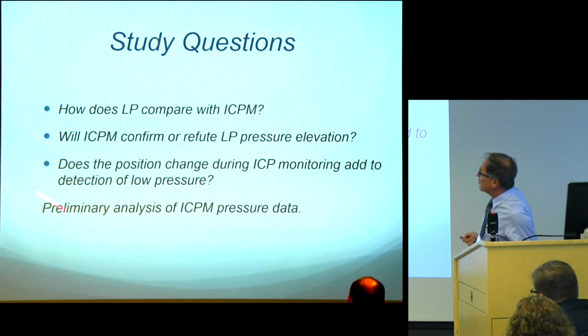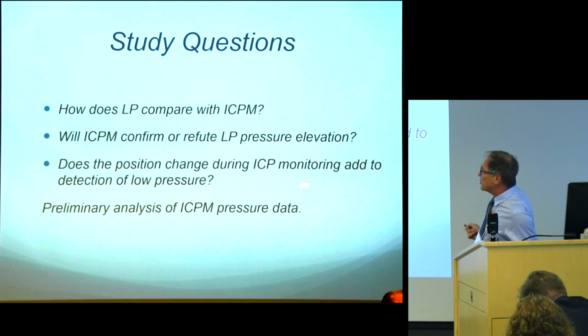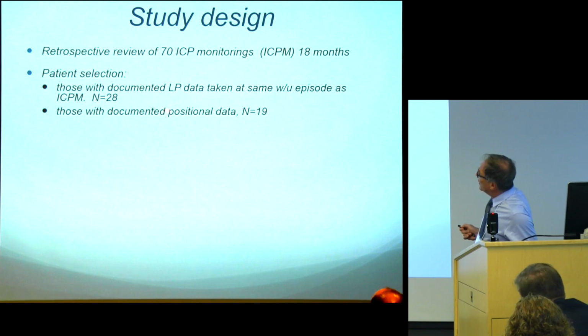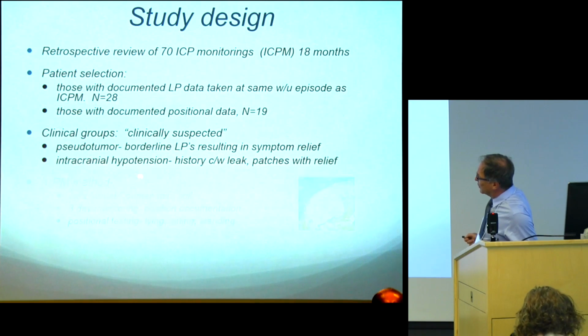The questions in the study that we did, and I'll go over this in about 2 minutes, is how do LPs compare with our new ICP monitoring, and do they refute or confirm the LP pressures, and does changing position give us additional information in terms of CSF leaks? So the design was to take those patients, and in 70 ICP monitorings, we found 28 that had enough reliable LP data documented, and reliable documented positional data.